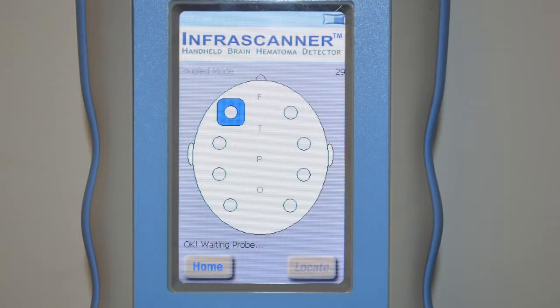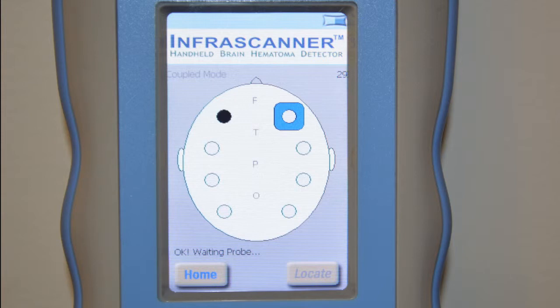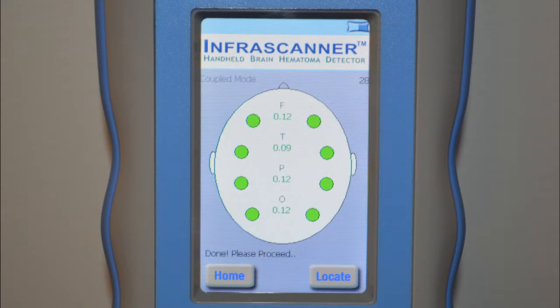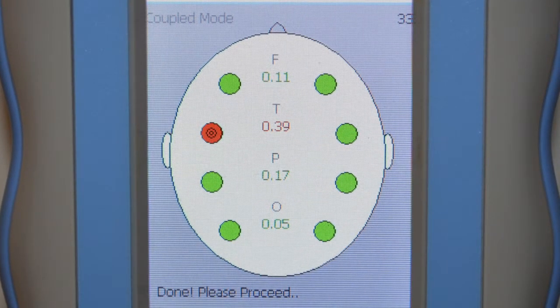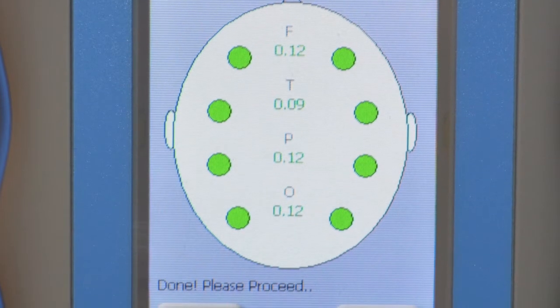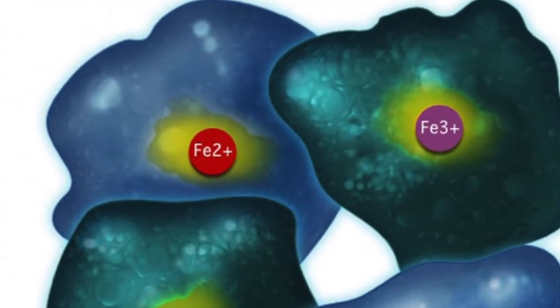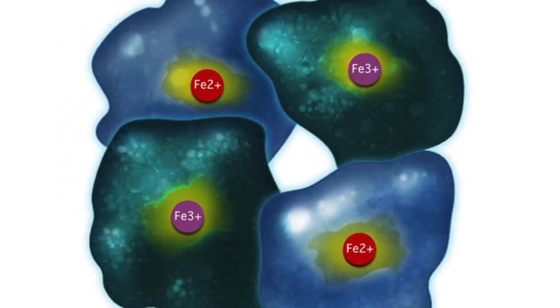When taking a measurement, the blue square tells you where the next scan should be taken and the black dot indicates where the measurement is done. When both sides of one location are completed, a green circle for negative or red circle for positive will show. Numbers below the F, T, P, and O on the head diagram show the relative optical density difference between left and right sides. Anything over 0.20 shows a positive or red reading; 0.20 and below shows a negative or green reading. This threshold was based on a pilot study of TBI patients and healthy volunteers to maximize sensitivity and specificity. The near infrared signal decreases over approximately 72 hours due to natural breakdown of hemoglobin into methemoglobin, so the InfraScanner will not detect a chronic hematoma.